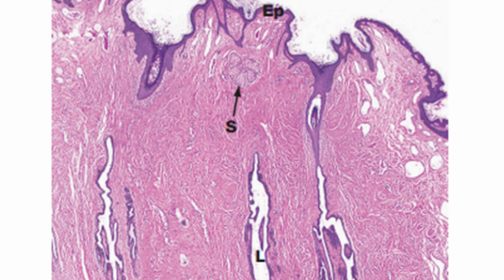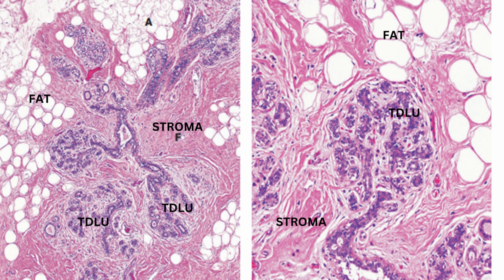Okay, starting with the pictorial description of each part of the breast. First is, we know that whenever there is a mastectomy specimen, we take a section from the nipple areola complex. So this is a section of the nipple. So this is the surface epithelium, right? And then we have a single sebaceous gland, and then L is what is your lactiferous sinuses which are present.